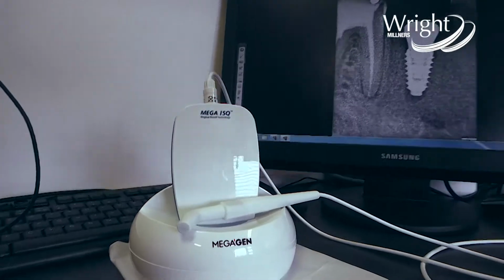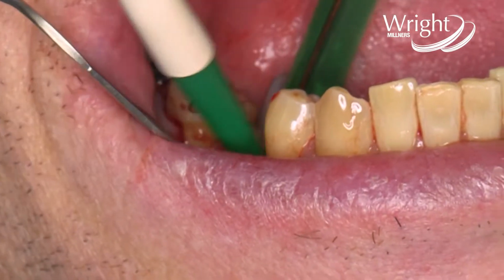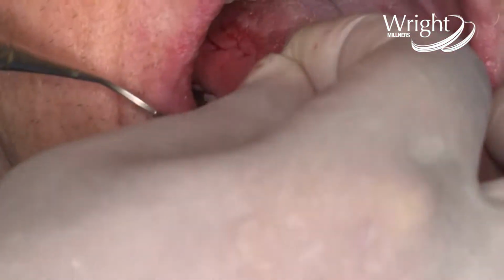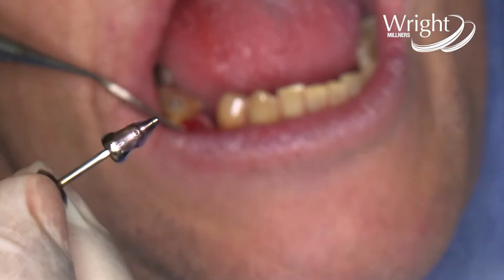Now then, the ISQ, which we mentioned earlier. Before you insert the smart peg, with your sterile water, rinse out the inner well of the implant, and you can see it's 78, 79. So now we've got to choose our healing abutment. Here we're using a 5 diameter and a height of 4 millimeters. So that's the healing abutment.